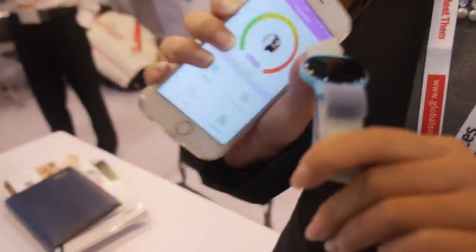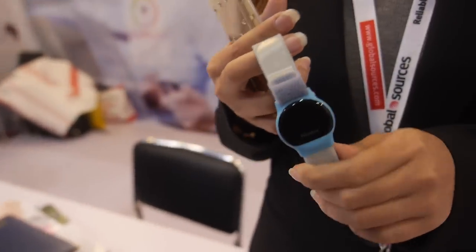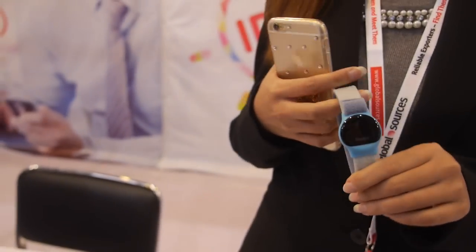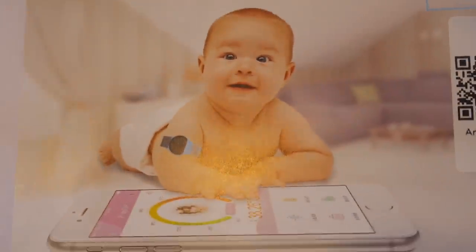The new product you have here - what are you showing? This product is our new product: a smart baby thermometer. You put it on the baby's arm - it's an arm device for babies.